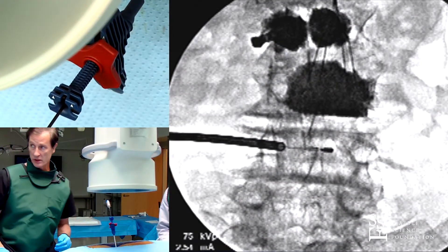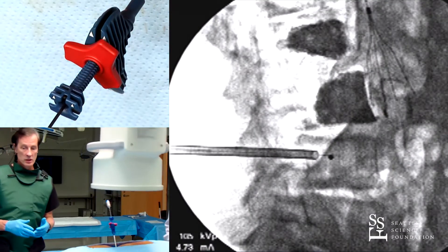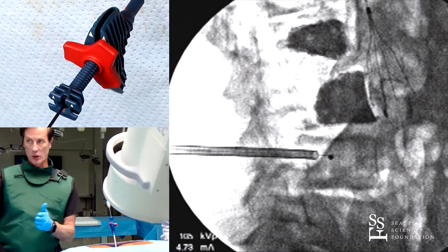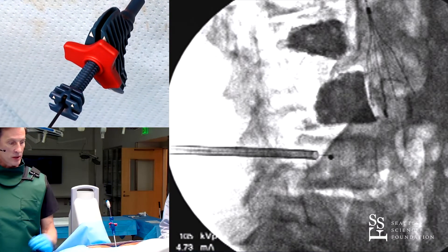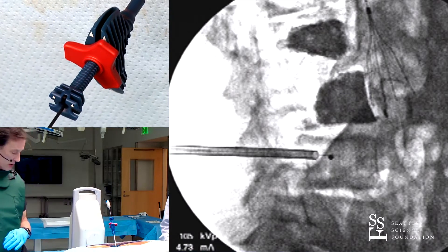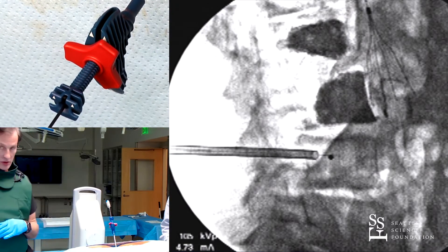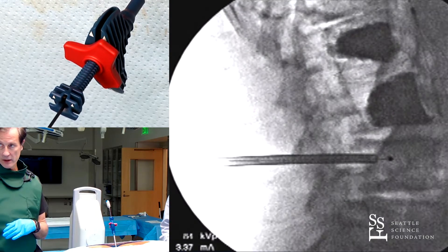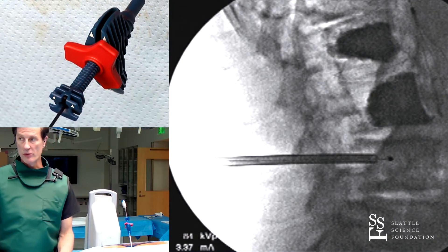Perfect. Let's take a look at that lateral, let's save that, hook it up, burn 85 degrees Celsius for about 15 minutes. And as you're burning we go on to the next level. As mentioned, at minimum there'll be two burns for one disc - and we like that a lot. Minimum two burns for one disc.